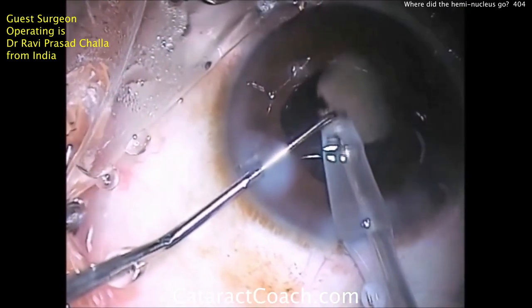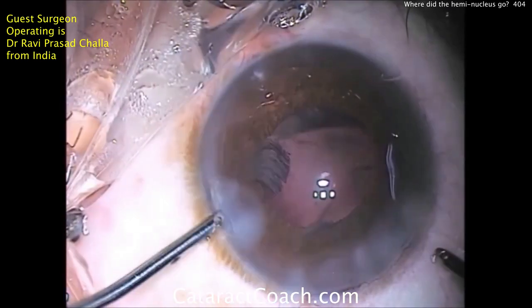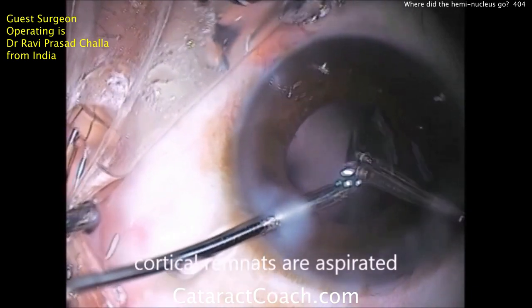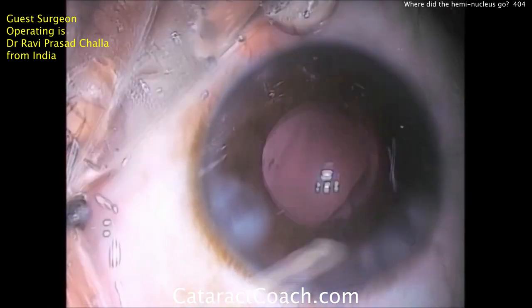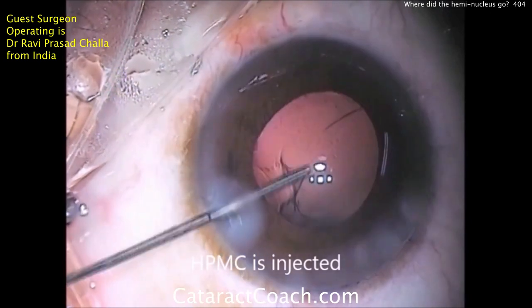He's absolutely saved it. Now, would I have faulted you if you said just let the piece go back and have your vitreoretinal colleague do a pars plana vitrectomy? No, that'd be perfectly fine. And in some cases, if you're unable to reach the piece, let it go — don't fish for it. So now that the nucleus is entirely removed, he's going to fill the capsular bag and insert the lens.